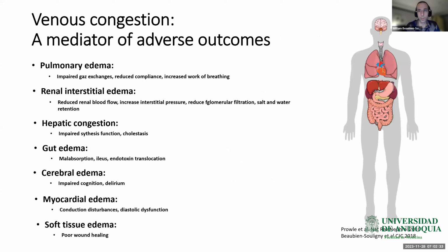This graph shows the relationship between portal pulsatility at T1 before bypass and T2 after bypass. Interestingly, when looking at major complications, if portal vein was normal at T1 and T2, the rate of complications was 19.8%. If portal vein was abnormal both at T1 and T2, the complication rate was higher at 27.6%.